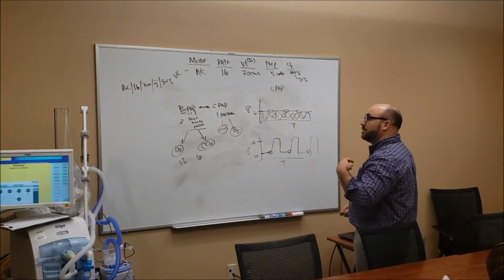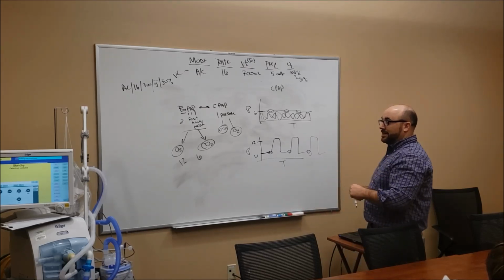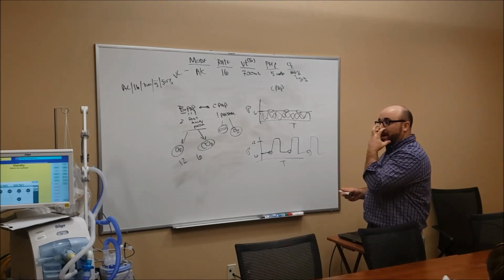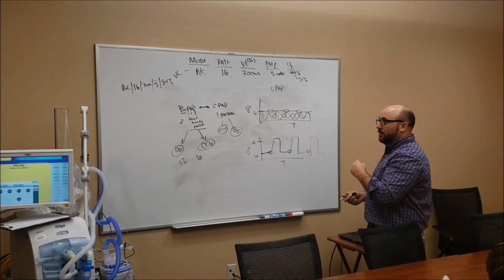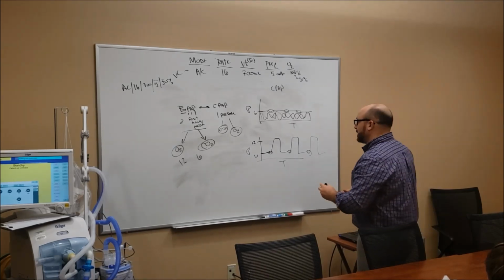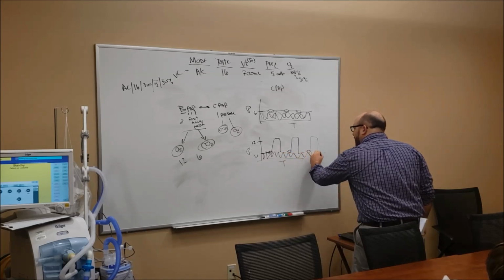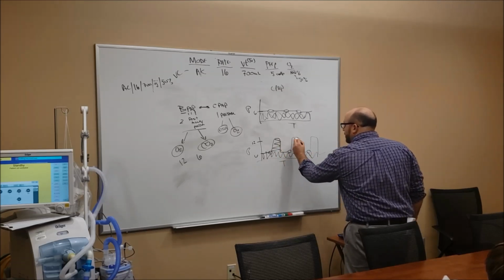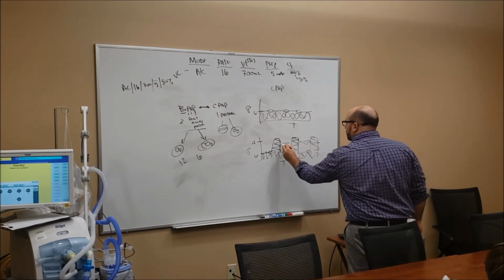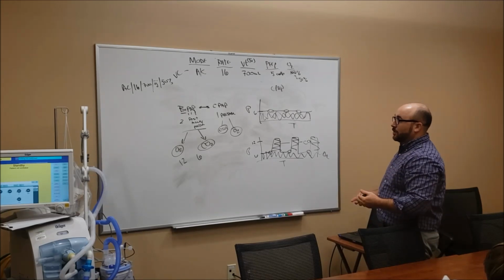But if somebody takes too much medication and their respiratory rate is falling, a BiPAP is not going to do the job, because the BiPAP mask can actually fluctuate. It will trigger and fluctuate on its own, but you have to have mechanical movement to get the air in. The patient has to make some effort. So with BiPAP, we have this area of oxygenation, but then we have these tall towers of ventilation, or getting rid of CO2, okay? So that's how we decide which one to put them on.